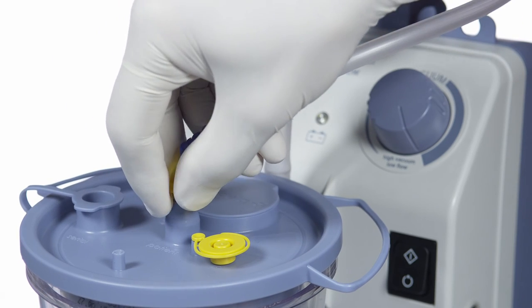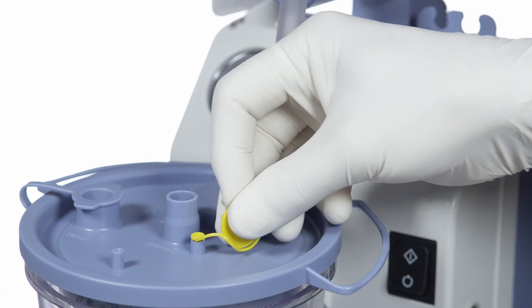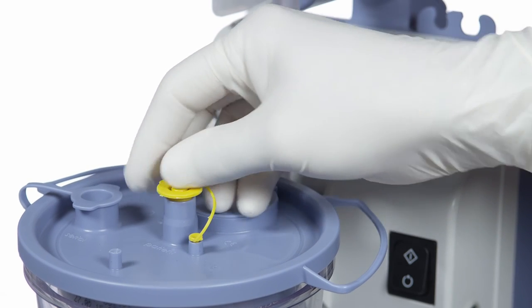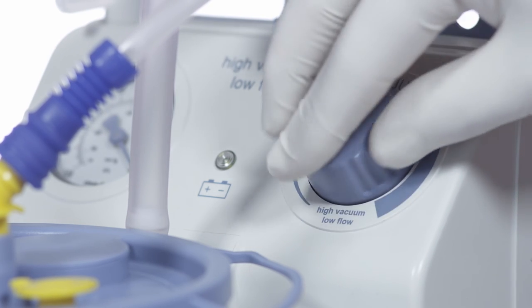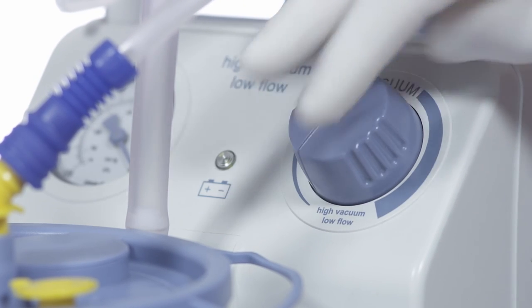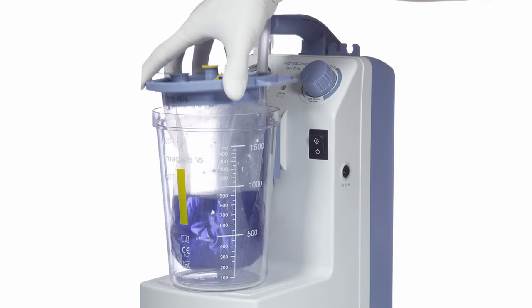After use, remove the disposable tubing and plug the patient port on the liner. Turn off the pump and reduce the vacuum to zero. Remove the disposable liner and dispose of according to internal guidelines.